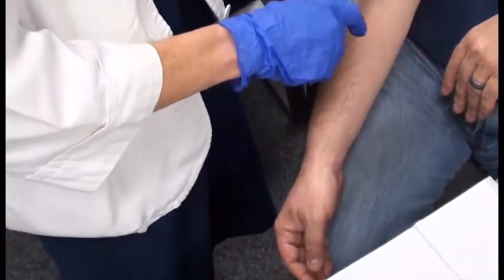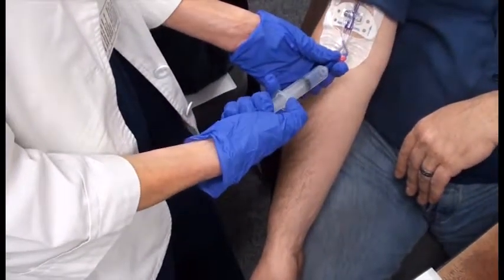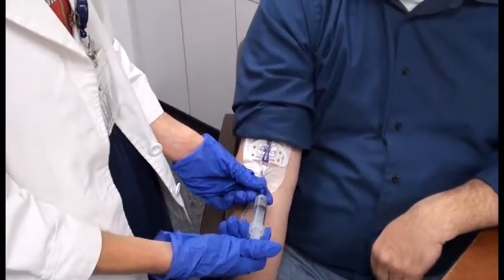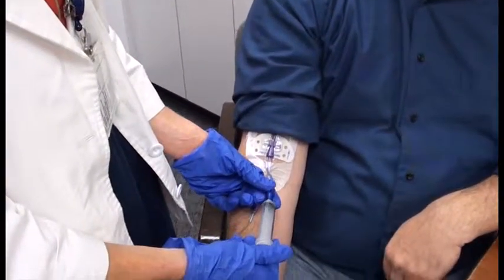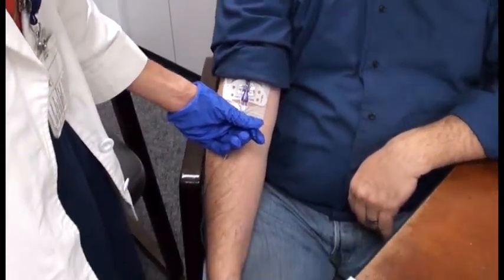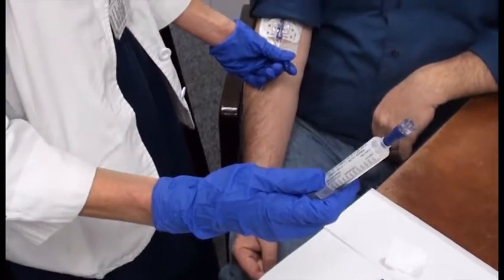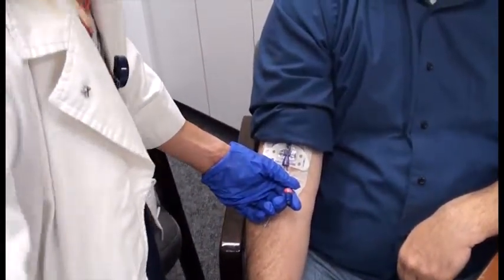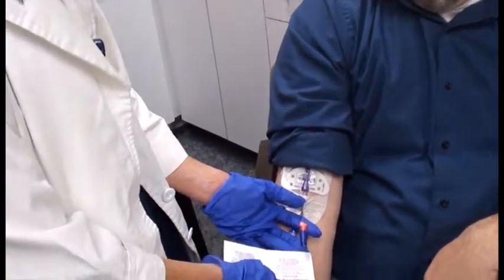Your first flush with your saline will clear the line. So as you complete your first flush, you would unhook your syringe, and then your second flush would be ready to go with your primed cap. And you'd be ready then to change the cap as demonstrated earlier.